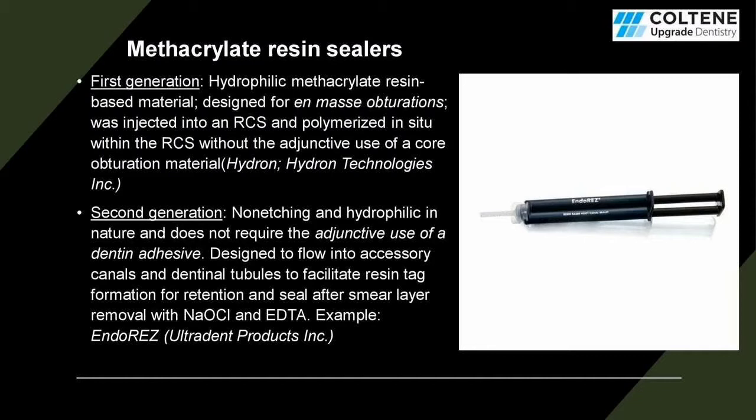There are many advantages of it. It's designed to flow into the accessory canals, and the main thing is that it forms a resin tag formation. The one thing that we require in composite, like the bonding with dentin and all, it has a very good resin tag formation, which helps in the retention of the seal after its placement.